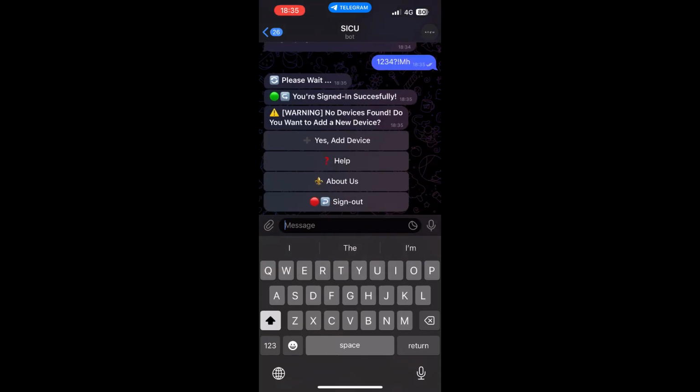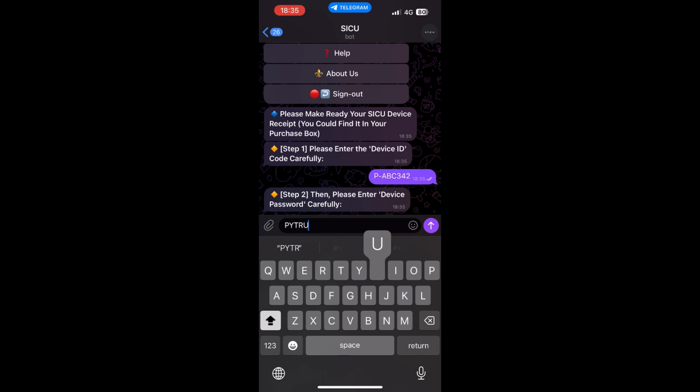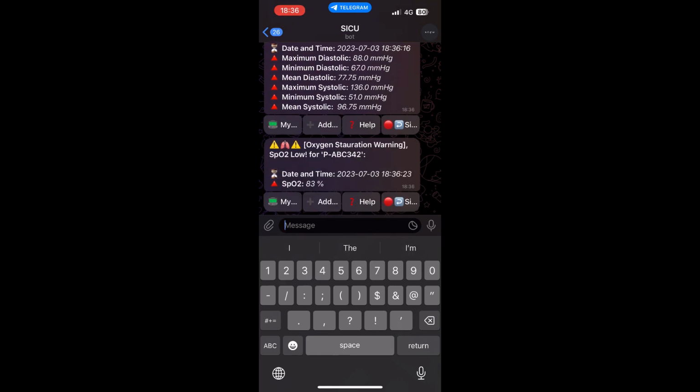The system checks this username and password with the catalog to see whether they exist in the catalog or not. At this time, you must add your device by entering the device ID and the password ID. You can find them in the purchase box. Now your device is added and you can see the report and warning notifications of your device. For example, you can see a blood pressure report and an oxygen saturation warning.